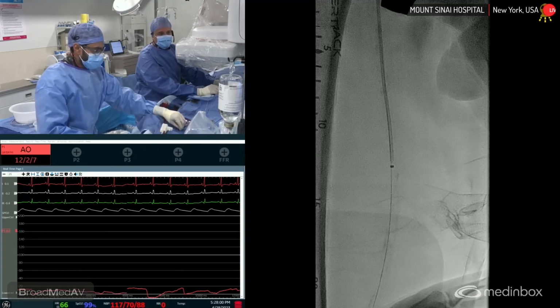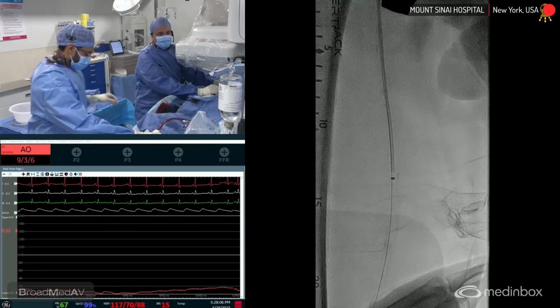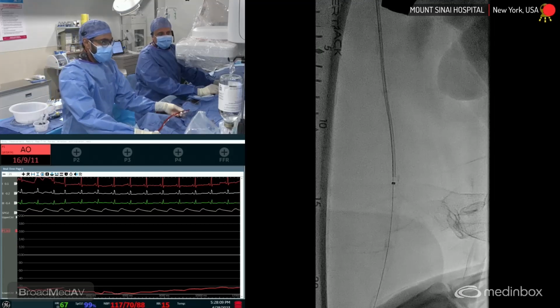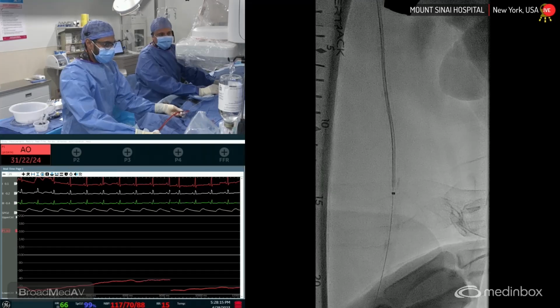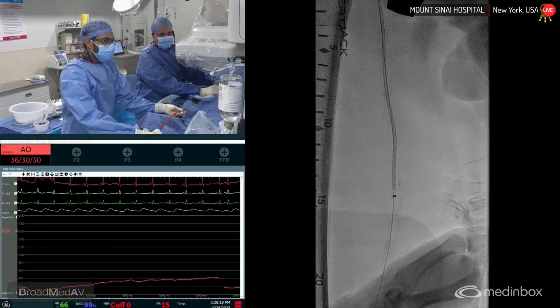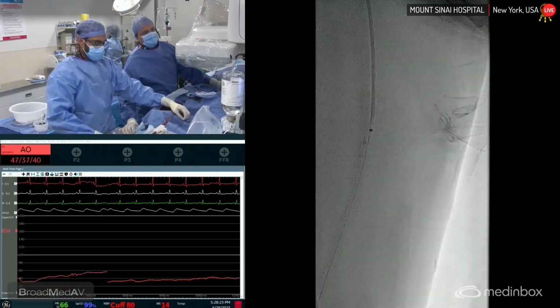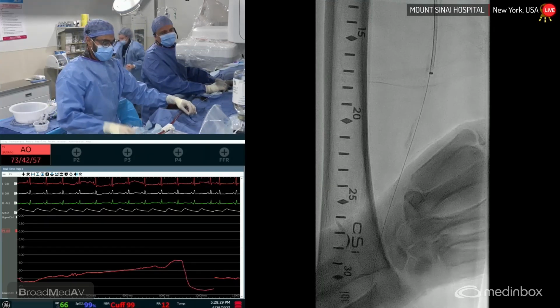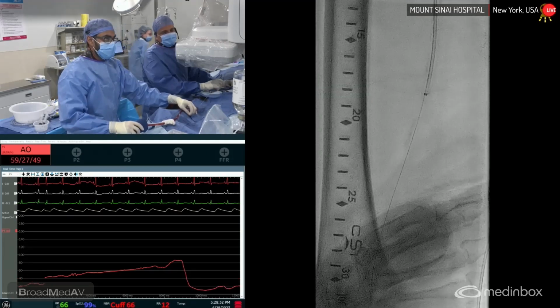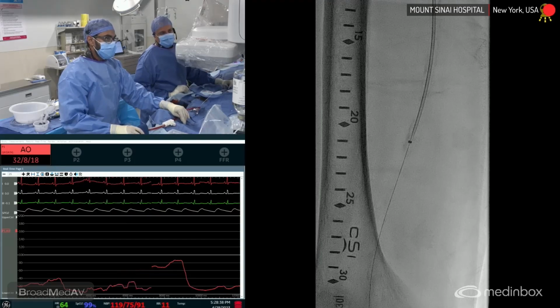So you can see here we're going very, very slow and allowing the catheter to do the work and really allowing the catheter to suck all the thrombus out. I know I have some occluded segments, which I'm really not trying to push through, but I'm trying to let the catheter work its way through, which it's trying to do. But in this area, it's not. So I'm just going to let it sit. There it goes. I'm just going to let it sit here and aspirate as we go down. It's lavaging and aspirating the vessel. And then as you can see, I'm going to try to take it through the occlusion and see whether we can easily aspirate the vessel and make it look really, really pretty.